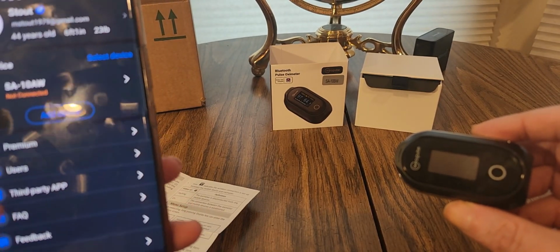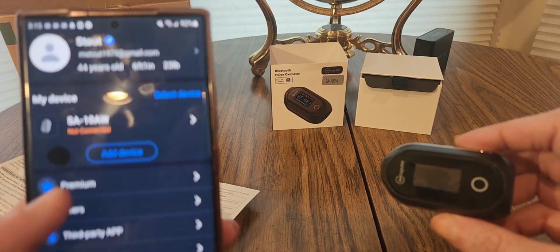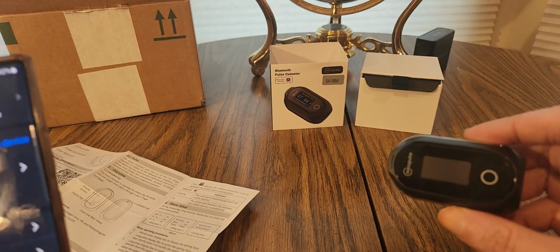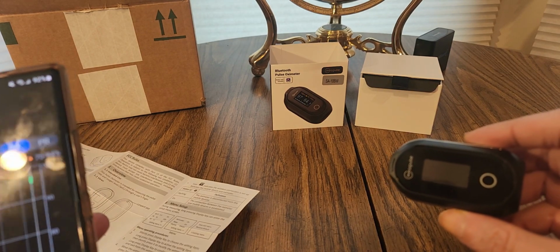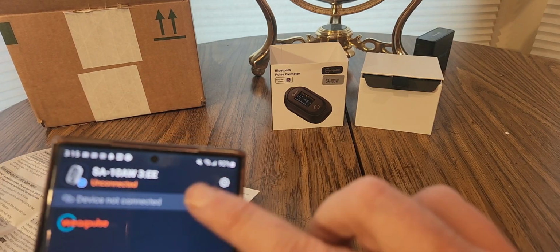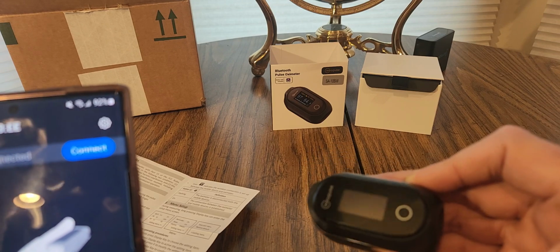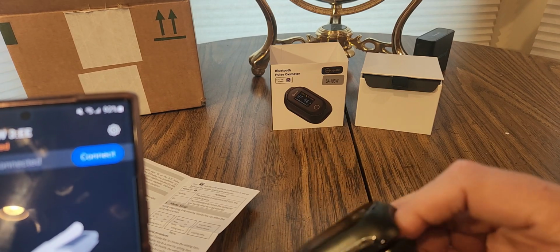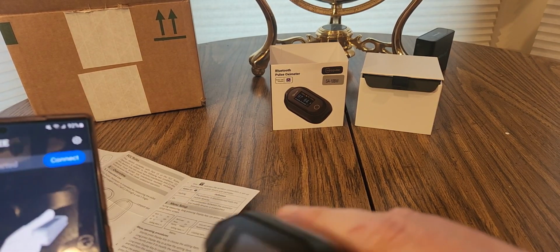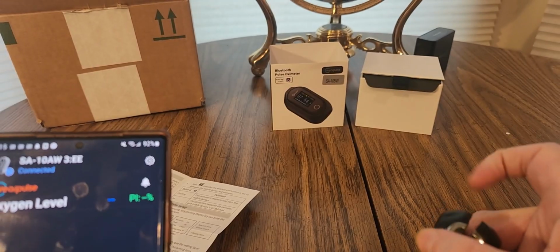You can join the premium they have going on. And there's my age and everything, email, contact, dashboard. If it's not connected, you could connect. Should connect easily. But once I put it in, there you go. See? Bada boom, bada bing.